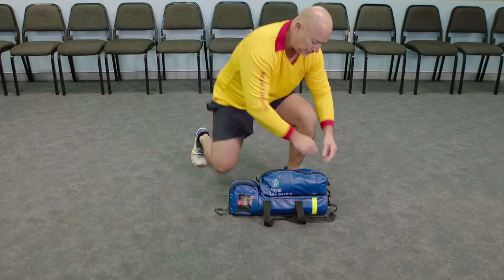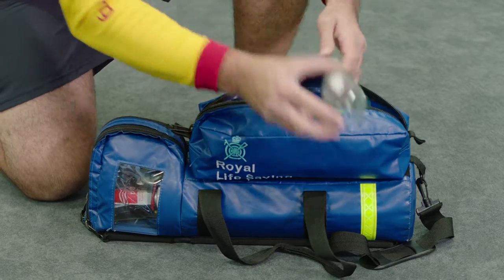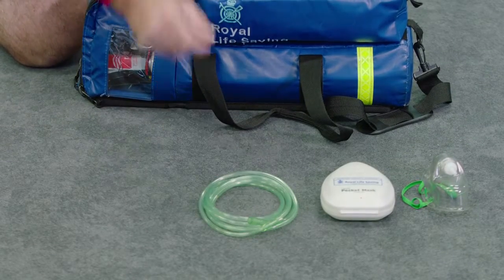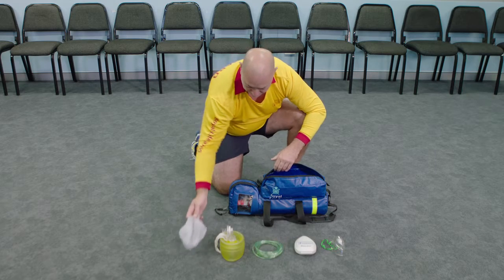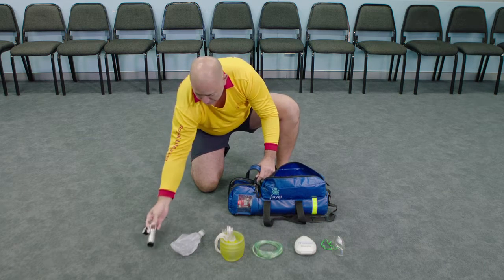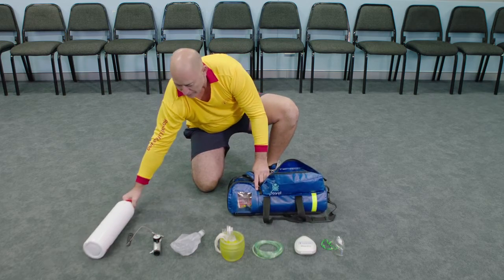The components that should be included in an oxygen equipment bag are: a therapy mask, a resuscitation mask, tubing, a bag, a reservoir bag, a regulator, and a medical grade oxygen cylinder.